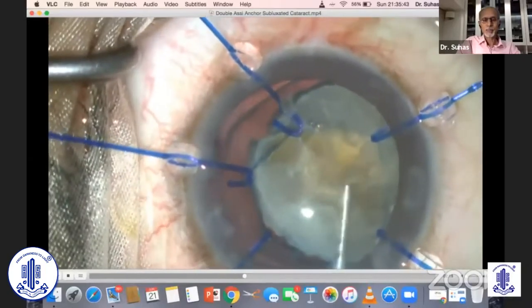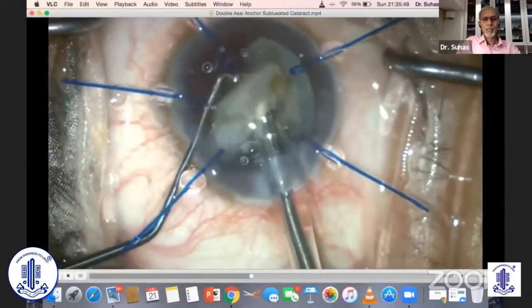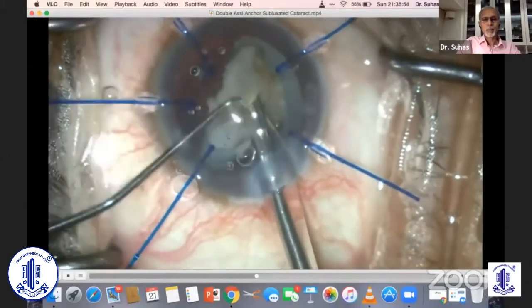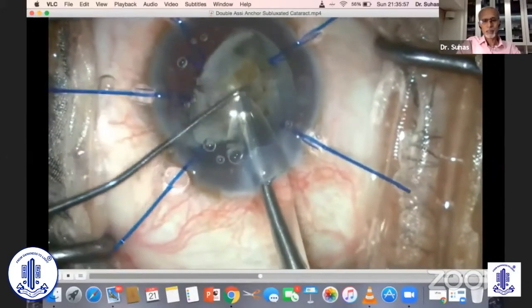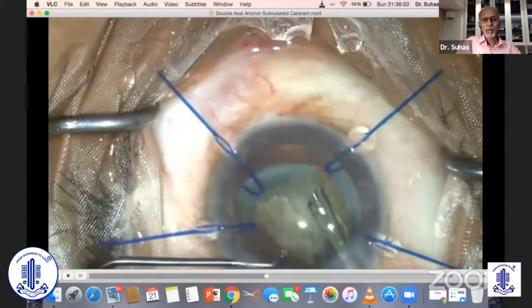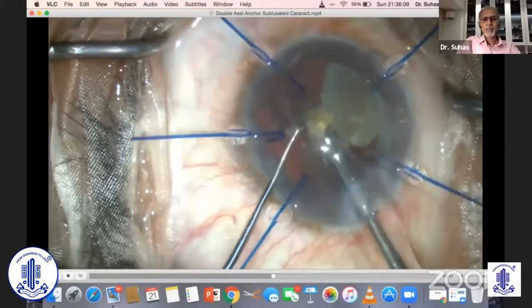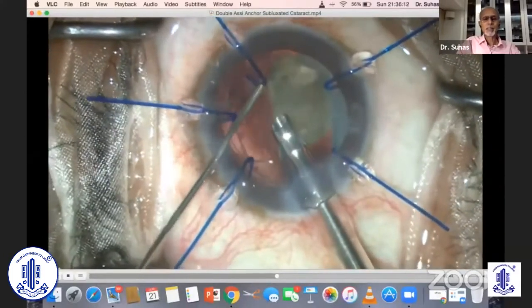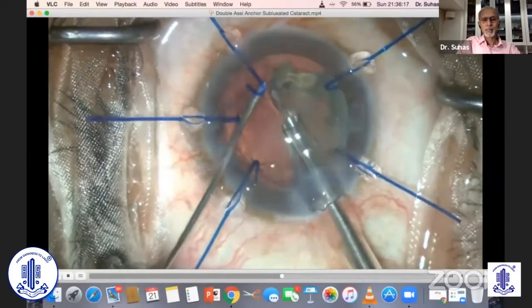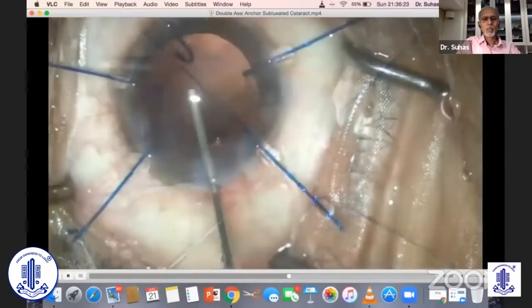I'm using my bevel down to pick a nucleus piece and bring it anteriorly. With patience and repeated adjustments of your phaco dynamics, you're finally able to get most of it. Even at this stage it's safer to inject some more viscoelastic so that you have your final piece out, and then you would clean the bag.